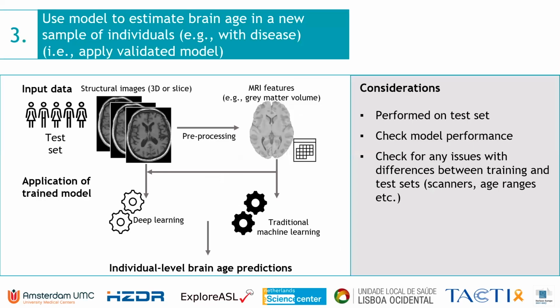So then once the training and validation procedure has completed and I am happy about how my model is performing in my training and validation set, then it becomes more exciting, because then I can actually use this model and apply it to a new data set. As you can see, the slide hasn't changed that much from the slide before, only that now I'm using the test set, where I have to again do my pre-processing steps in a similar way depending on the model that I just used.